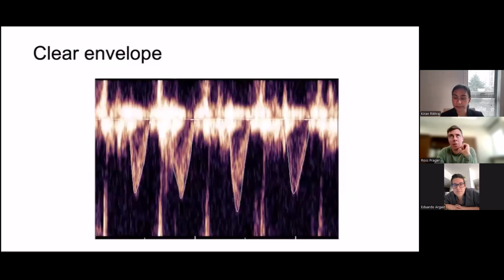I'll just make one comment. The most common cause that I see for this is that the Doppler angle is just not well enough aligned with the LVOT. If you measure any LVOT at 30, 35, 40 degrees, you get this envelope.